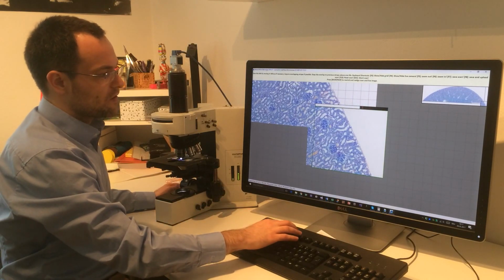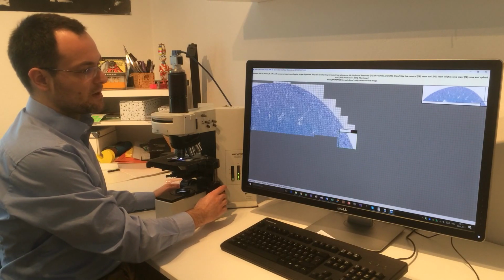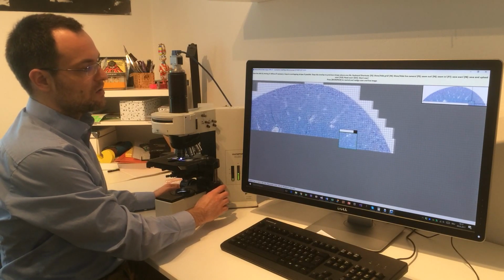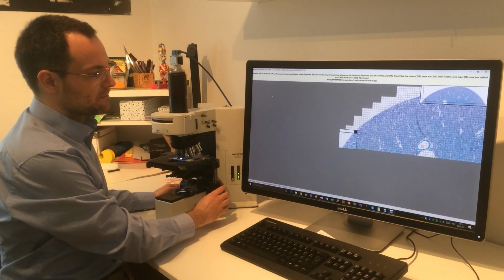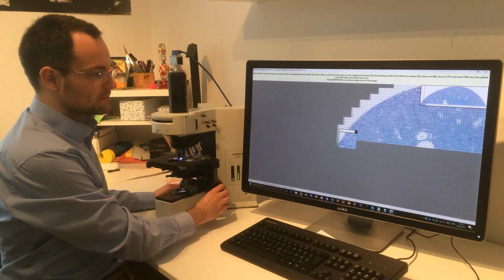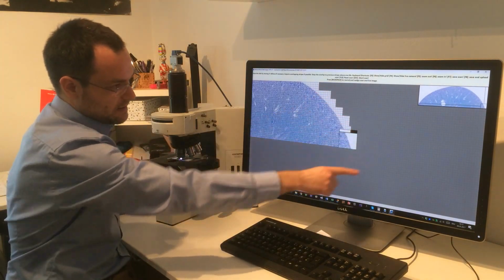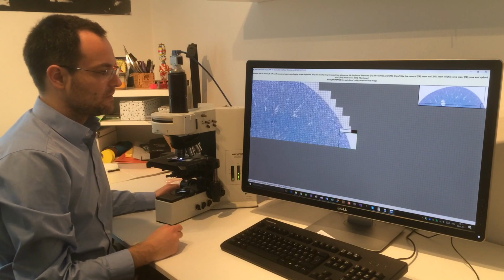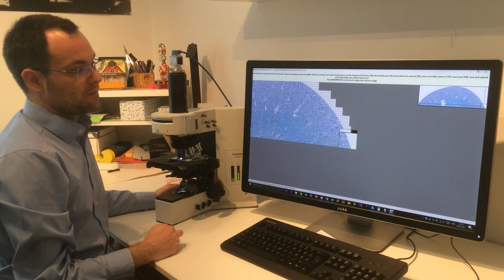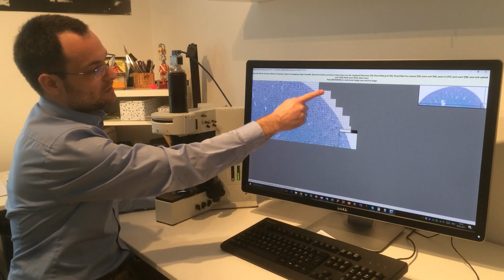If you want to have more overview, you can zoom out by hitting the F5 button or zooming in by hitting the F6 button. The background is gray, the area where you didn't scan. This area will become the same white as the background here.